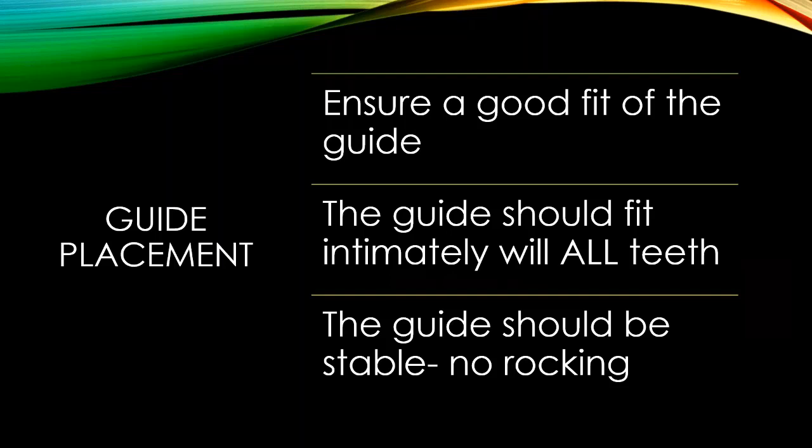So guide placement. Now this is a test to how good our original data was, our scan or our alginate. You know, we have to ensure good fit of the guide. The guide should fit intimately with all teeth. The guide should be stable. There should be no rocking. Much like, again, an Essex or a night guard, we should expect a very similar fit.